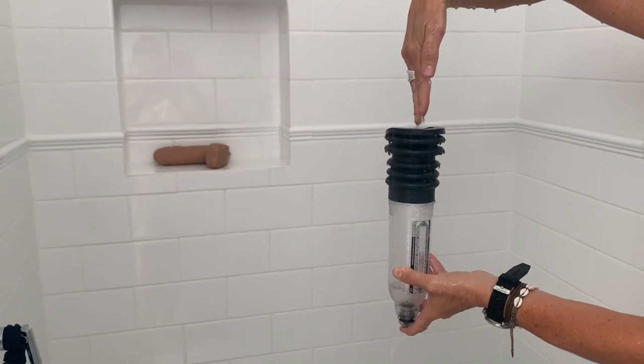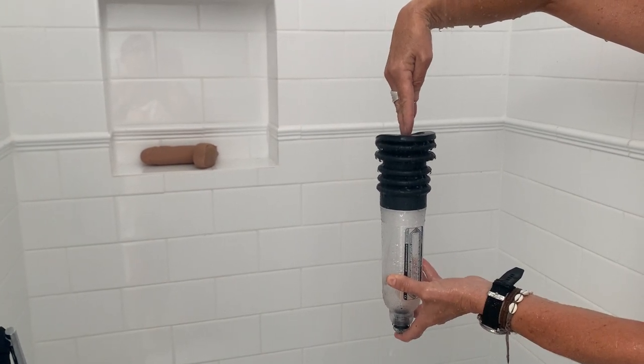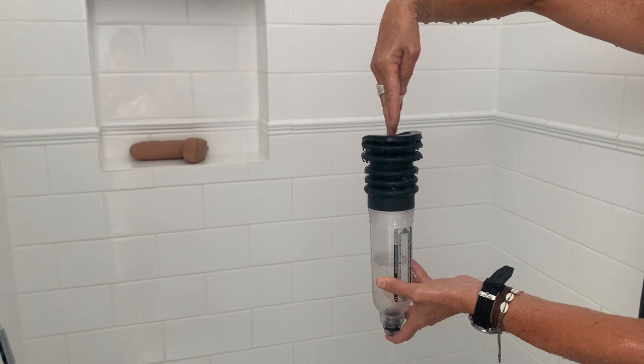Fill the pump up, or if you had a tap in your shower you can put it under the tap, but this is the easiest way. It does take just a few seconds.